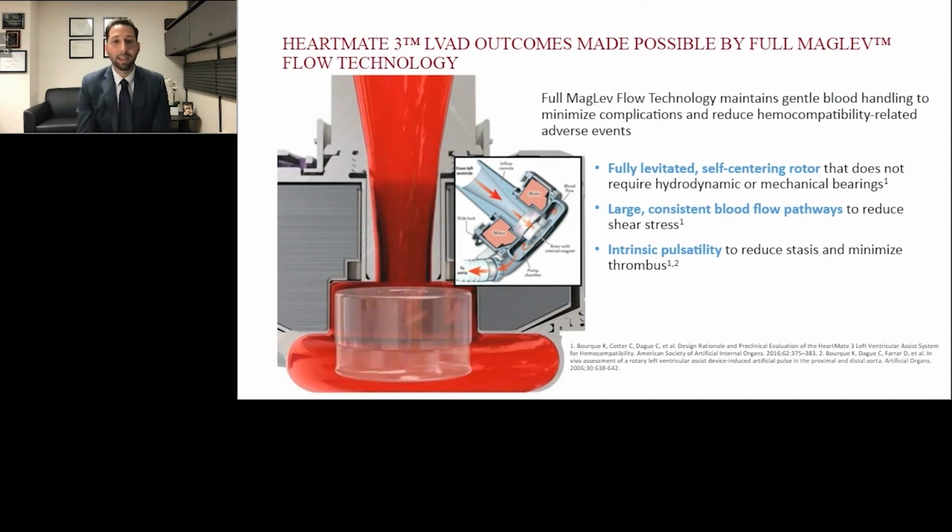So this slide highlights some of the key design features of the HeartMate 3 that have the objective of reducing activation of the coagulation cascade, reducing shear stress, and improving hemocompatibility. The first design feature, as mentioned previously, is the fully magnetic levitation technology.